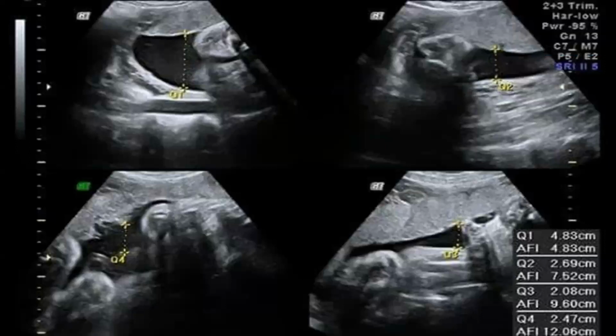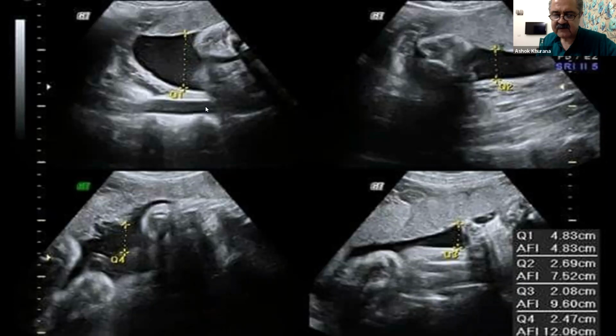We've also realized that in whichever pocket there was a fetal part or cord, that has been excluded, and we've only included the truly amniotic fluid portion of the depth. And then we've added up all 4 quadrants and got a final answer of 12 centimeters.